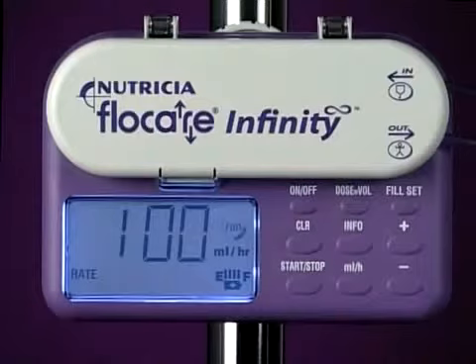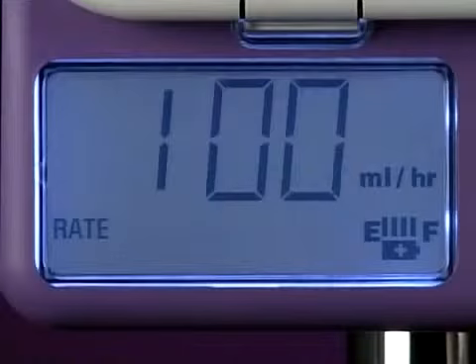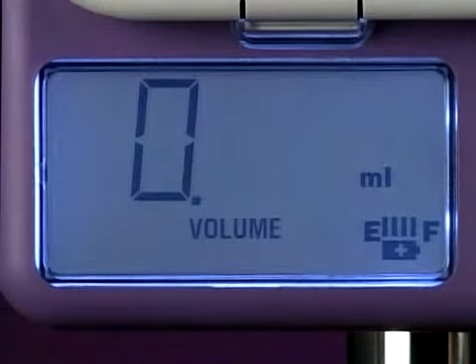Now is probably a good time to go through the pump's display. The display uses a range of symbols, including the run circle and the battery symbol. In addition, the words rate, dose, and volume are displayed below the relevant values.